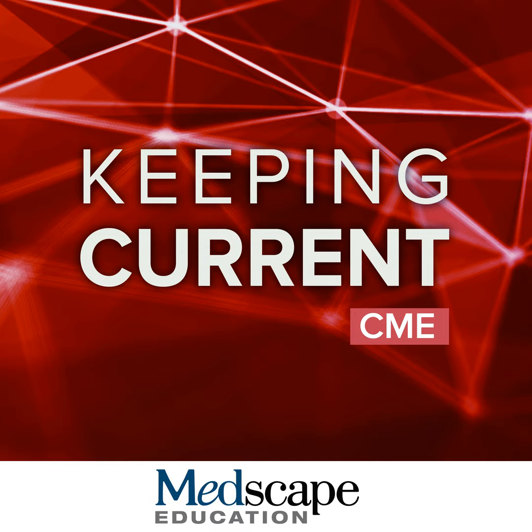So the first thing I would like to say is we make that decision individually for each patient. We look at each patient we schedule to get an MRI. We look at what is the clinical question that the referring provider is asking us, and then we try to tailor the MRI study to be able to answer that question. And that includes different factors. It includes deciding the type of sequences that will be included in the MRI. And as you mentioned, it will also include the decision of administering a gadolinium contrast agent or not.